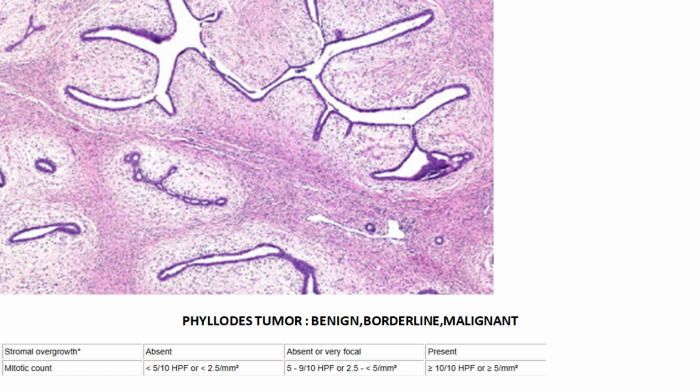That means your glands are normal. They might have a leaf-like architecture, called periductal stromal tumors. This is important to know that phyllodes tumor is also called a periductal stromal tumor. Okay. And again, if it is a high-grade phyllodes, it will have hemorrhage, necrosis, mitosis, atypia, and other components like squamous metaplasia or chondroid metaplasia. Phyllodes tumor is associated with its histologic grade. So if it is benign or borderline or malignant, naturally as we go more malignant, the prognosis gets worse.